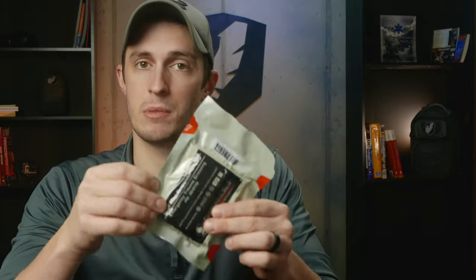You can also use this like an ACE bandage for a sprain or something like that, but primarily it's going to be used as a pressure dressing on top of wound packing.